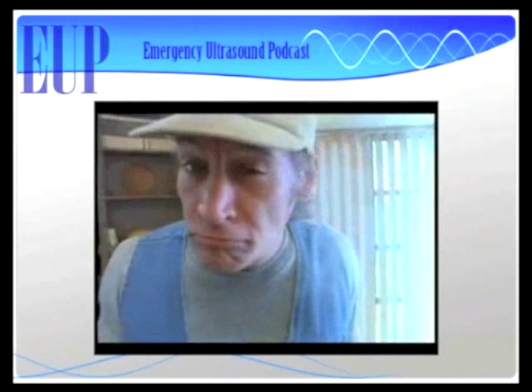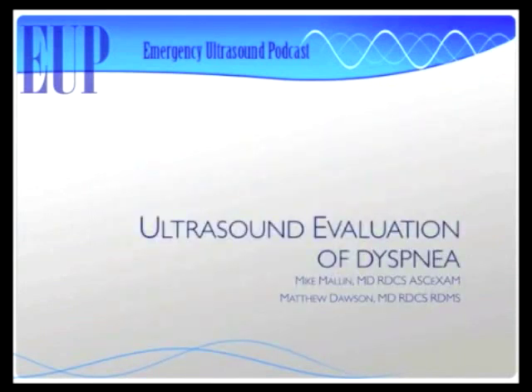Know what I mean? All right, Vern, so today we're going to be talking about the ultrasound evaluation of dyspnea. This is a guide to using your ultrasound machine to approach your dyspneic patient in the emergency department.